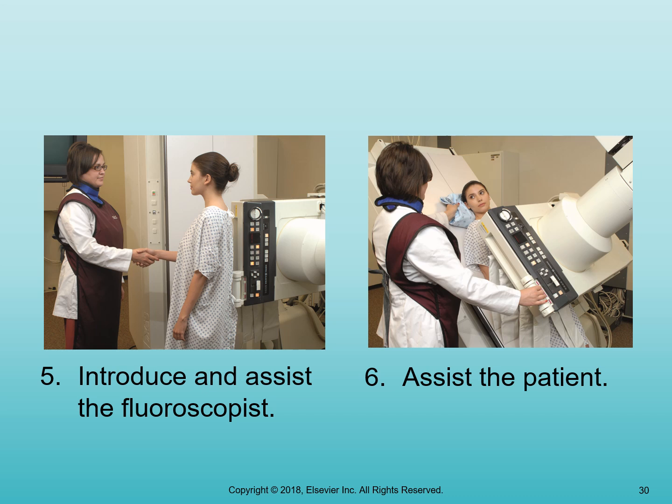You're basically going to take just an AP supine abdomen on your patient to not only confirm that they followed their prep, but it also acts as proof so that if the radiologist is reading something on the exam and the overhead images that we did and they question something, they have the capability to look at our scout image to determine possibly if the issue was there prior to contrast being given or if it's not noticeable without the contrast being given.